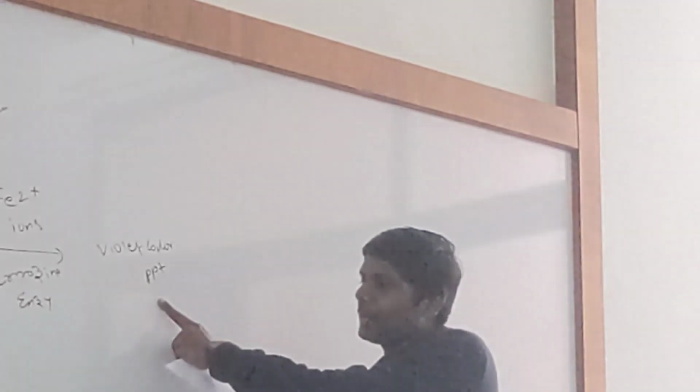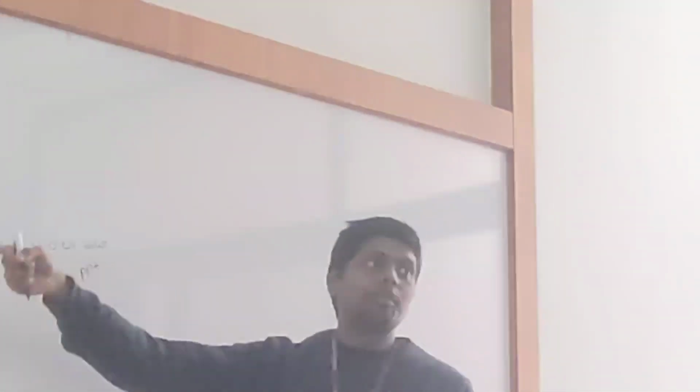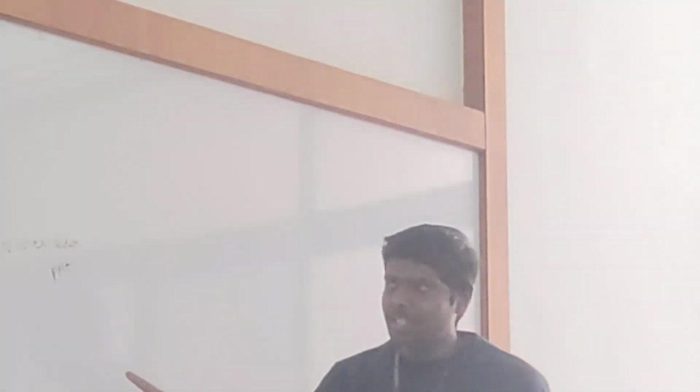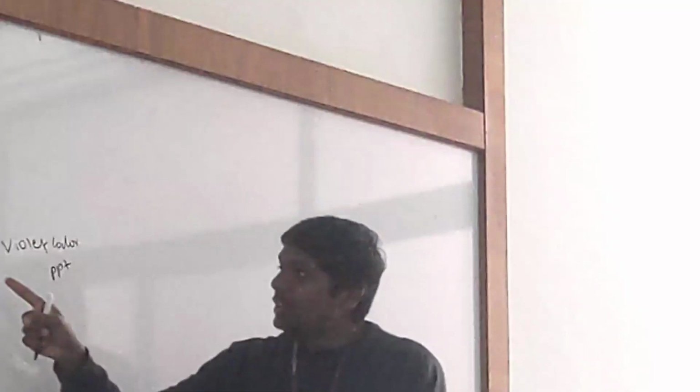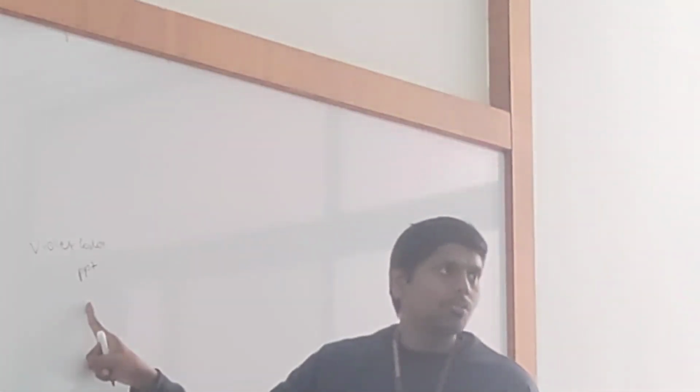The amount of precipitate follows Lambert's law. The more the iron molecules, the more the color production. Now listen. This value is giving only the iron value of the body.